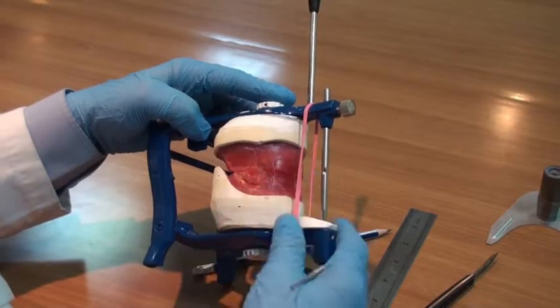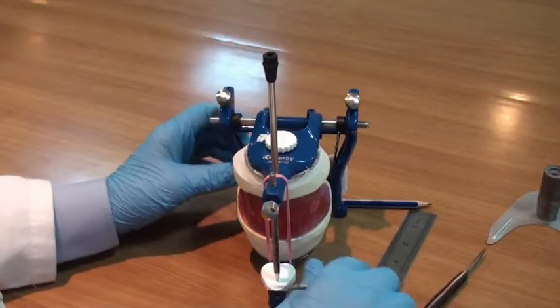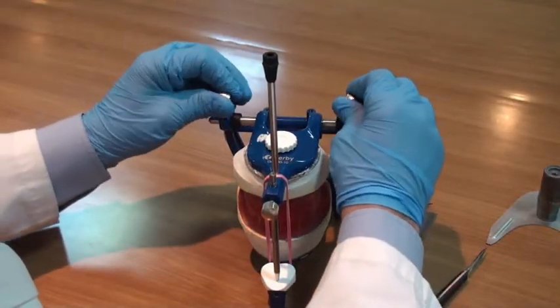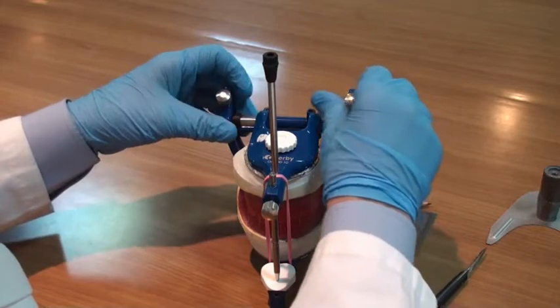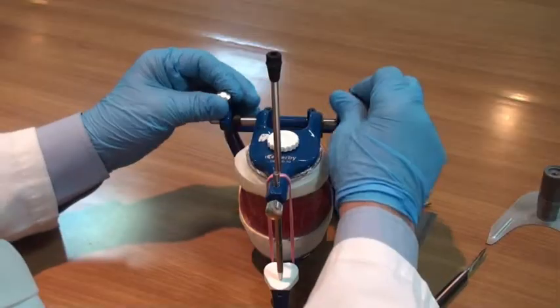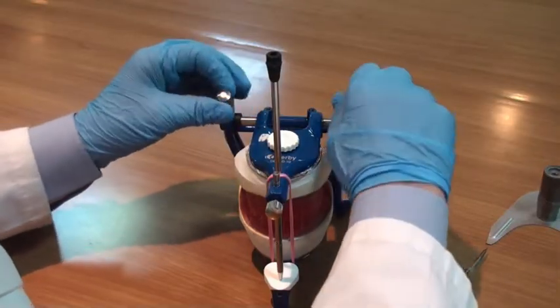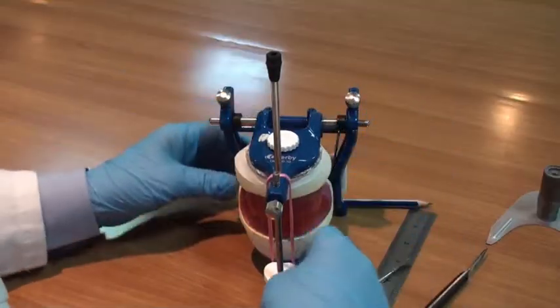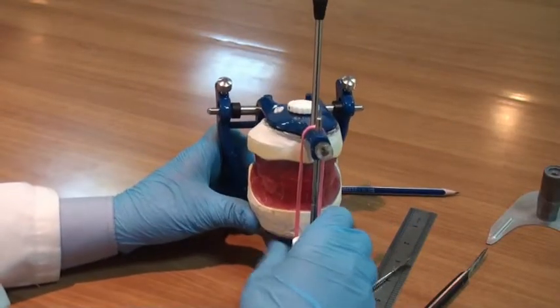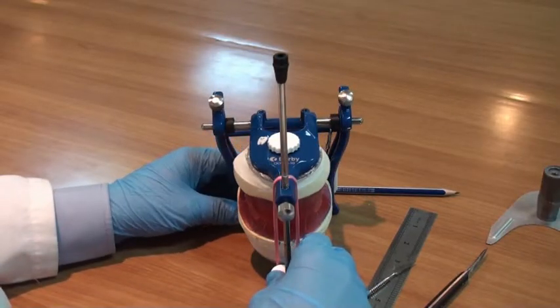This centric relation is securely preserved and protected at the articulator by the centric stops. Here we have the thumb screws. These thumb screws, which we call the centric stops, must be securely tightened at this stage, so no eccentric movement will be allowed in the articulator at this stage.